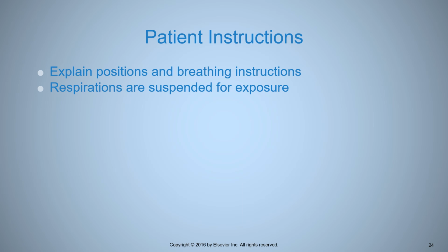Now there is going to be peristaltic motion occasionally, but usually the exposures are fast enough that you don't really get aggressive peristaltic motion in your hip and pelvis radiographs. That's more for small bowel follow-throughs and barium enemas, where you still see peristaltic motion because the exposure times take too long. So with pelvis and hip radiography, especially if you're using AECs, automatic exposure control, for your techniques, you should have rapid exposure times, fractions of a second, and so that'll help to eliminate motion as well.